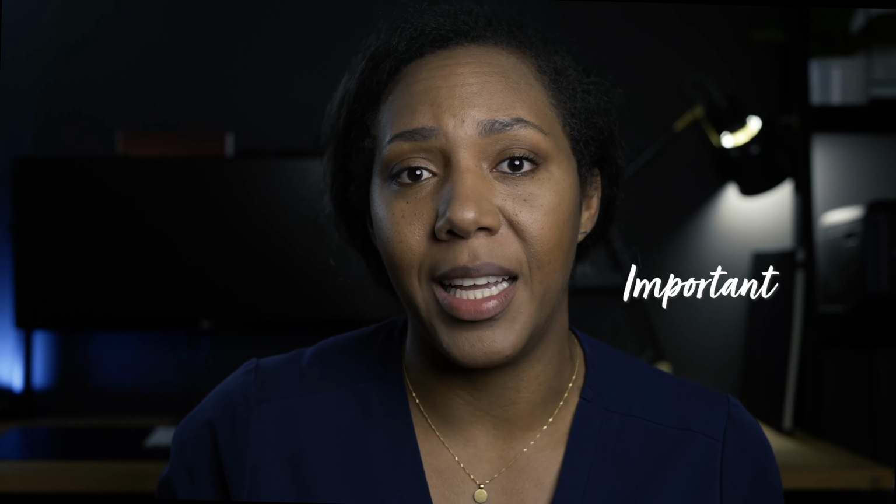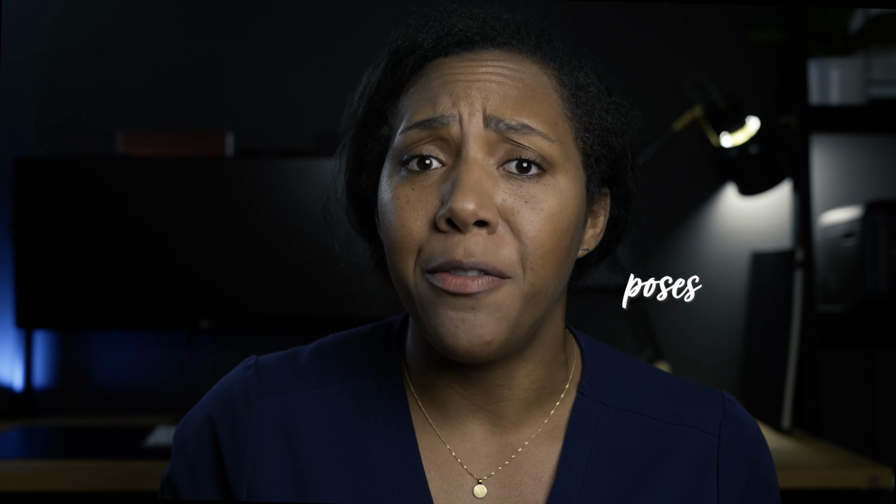I know, right? You didn't go to dental school to be a photographer. Well, guess what? Photography is very important in dentistry. And today we're going to mention the different types of shots which I've found to be proven in helping me in my dental career. So why is it so important to take photos?